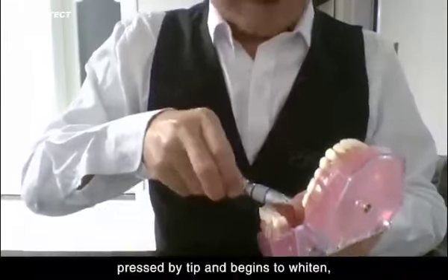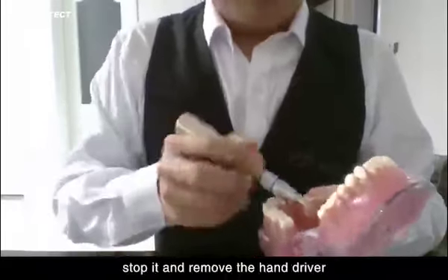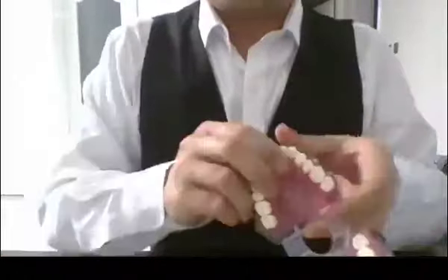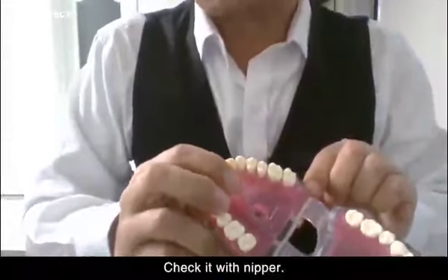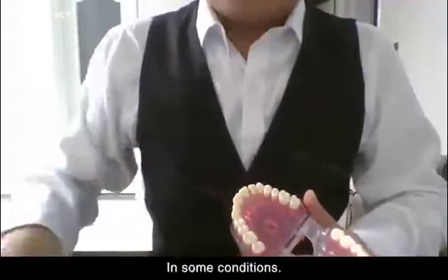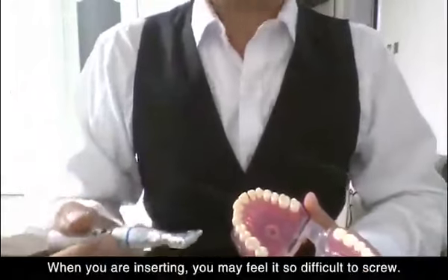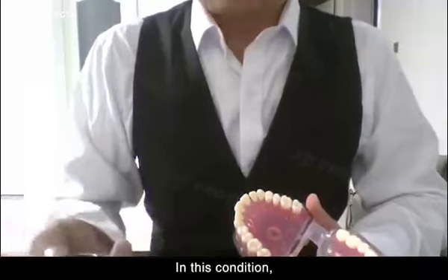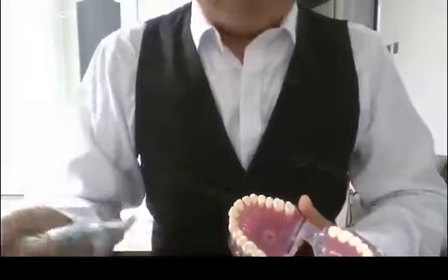When the mucosa is pressed by the tip and begins to whiten, stop it and remove the hand driver. It's okay. Check it with a probe. In some conditions, when you're inserting, you may feel it is so difficult to screw. In this condition, we should change the site or insert angle.